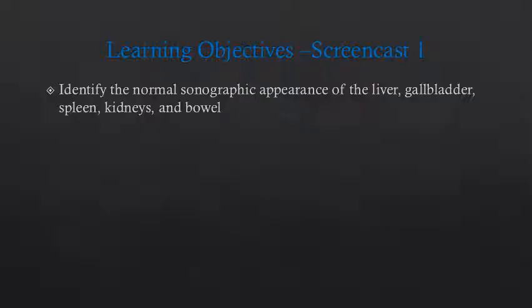For this first screencast, we will be focusing on normal anatomy. At the end of this screencast, you should be able to identify the liver, gallbladder, spleen, kidneys, and bowel on ultrasound.